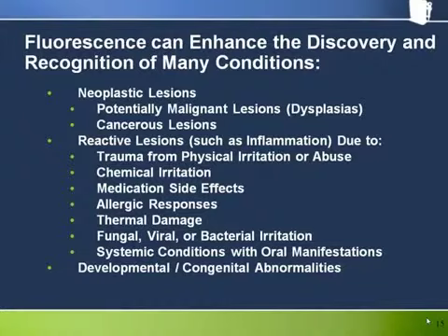Trauma, chemical irritation, side effects from medication, thermal damage, fungal, viral or bacterial infections, all of these will probably be more noticeable through the VELscope, mostly because of the associated inflammatory response. Note that persistent inflammatory lesions in the oral cavity can be symptomatic of a systemic condition which, if left undiagnosed and untreated, can be life-threatening for the patient.